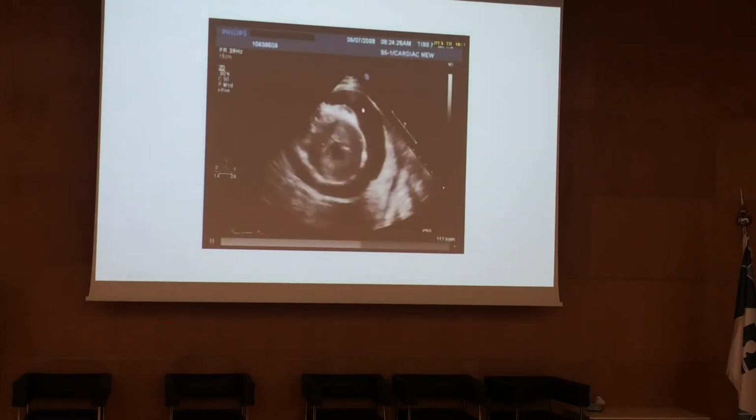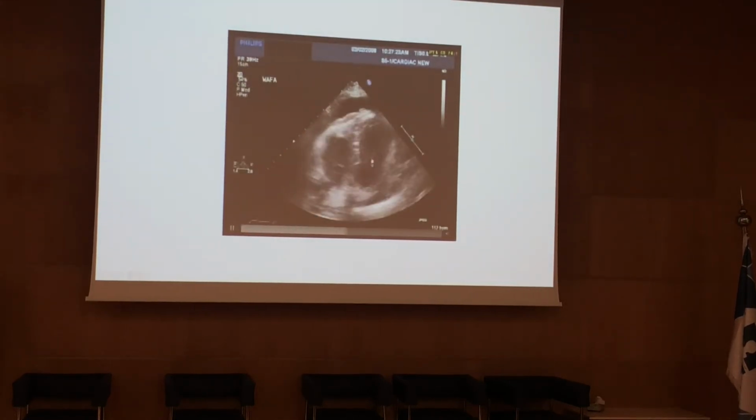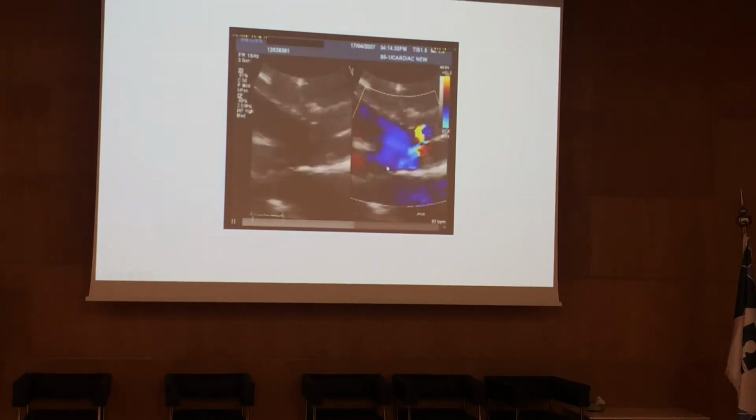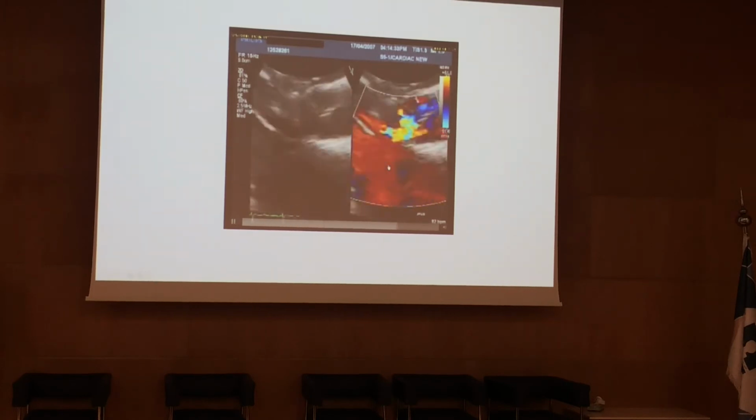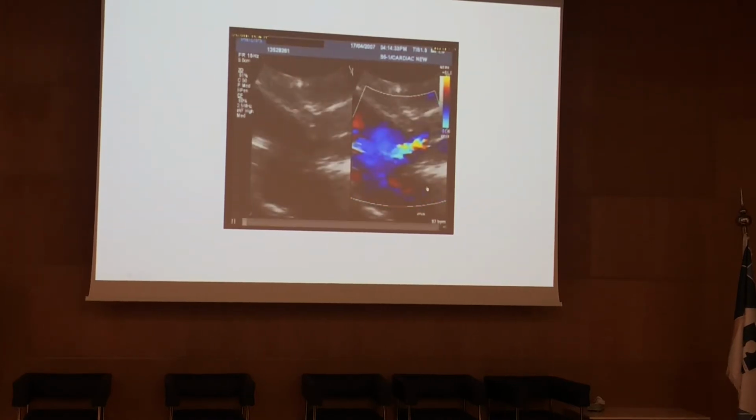Okay, again, here, see the pericardial effusion, how big is this? This is the apical four chamber. There's very clear pericardial effusion again, and there is collapse of the right ventricle. This patient might be in tamponade, so we need to tap the patient and clear the fluid to avoid collapse.